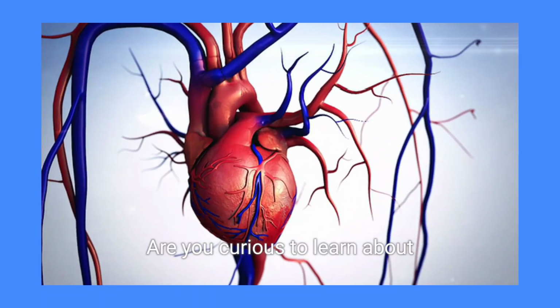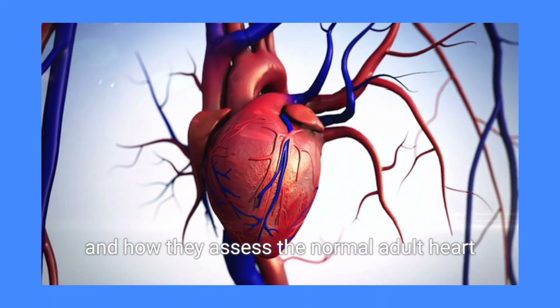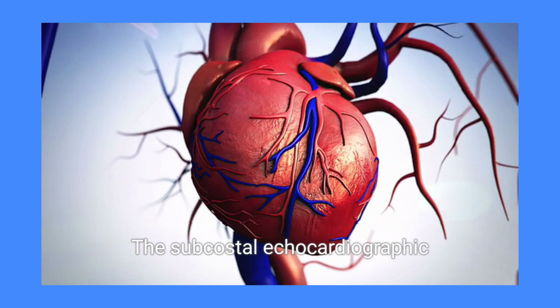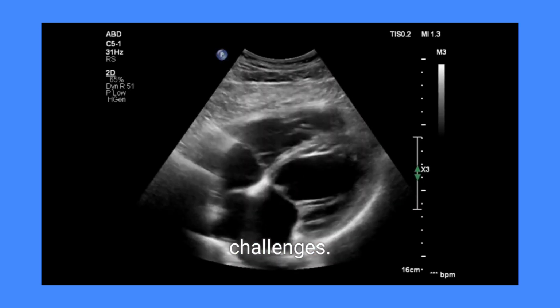Are you curious to learn about subcostal echocardiographic views and how they assess the normal adult heart and aortic valve? Well, let's dive right in. The subcostal echocardiographic view is an essential imaging technique, especially when traditional transthoracic views pose challenges.